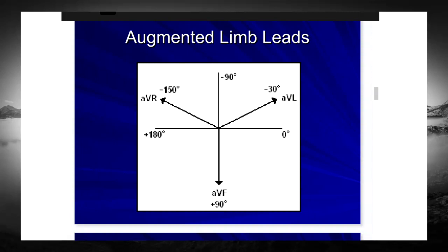Positive or negative, we'll say it that way. What direction should the impulse in AVR be? If we look at AVR on the ECG, you'll have waves that are either positive or negative. There are two waves that are important. I'll talk a little bit about this later. The P wave and QRS are the important ones to help us with our vectors and our axis. The P wave represents the atrial axis. The QRS represents the ventricular axis.